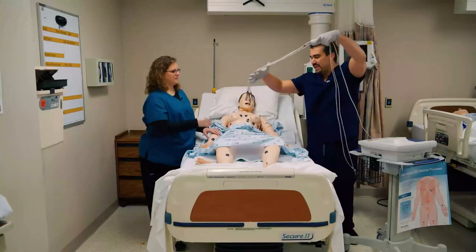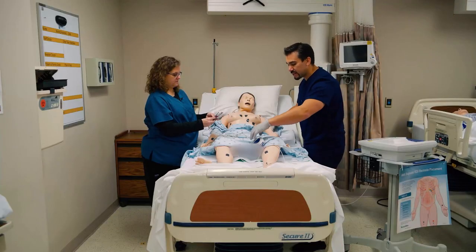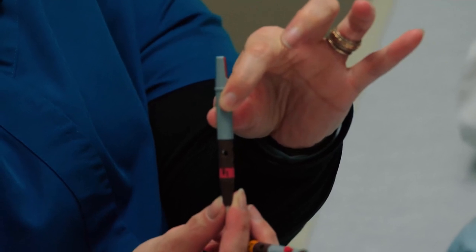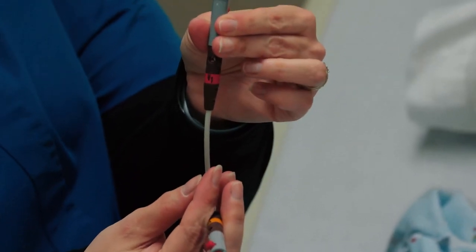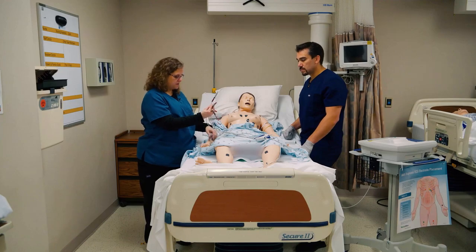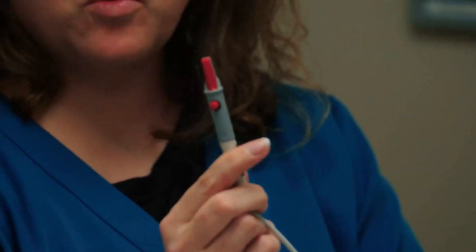Now for our leads — we have lower extremity leads, upper extremity leads, and then V1 through V6 for the chest. You can see this one is labeled V1. All the leads that go around the heart are V1, V2, V3 through V6. We also have labels like LA for left arm.